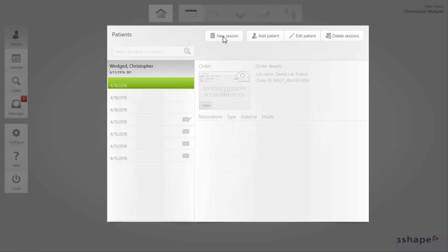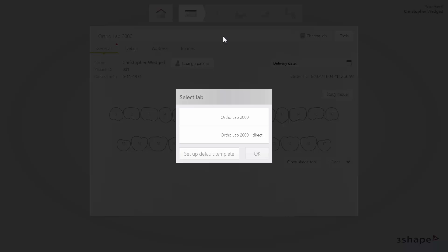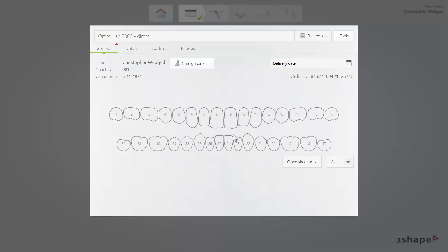While creating an order, you can choose between labs connected either by TRIOS Direct Connect or by TRIOS Communicate. Notice the labs on the list in the pop-up window include both connection types. For the purpose of this video, while choosing a lab, select the one connected via Direct Connect.